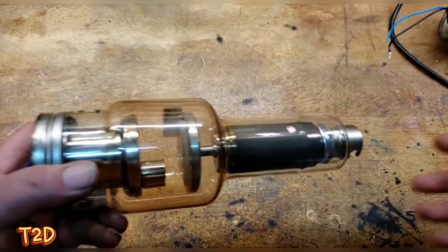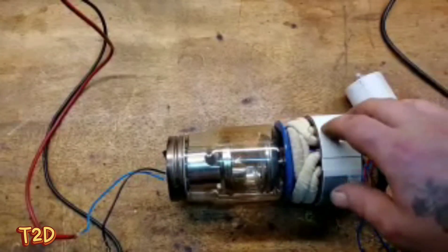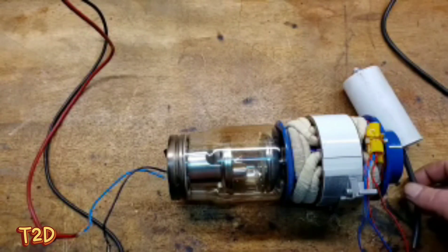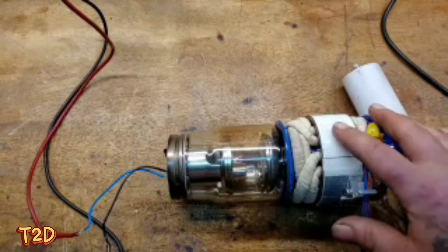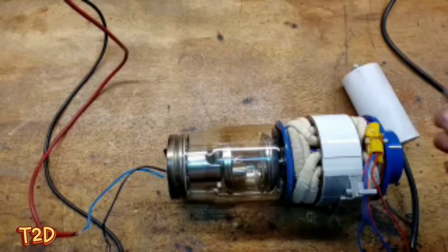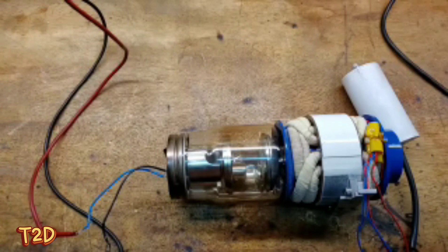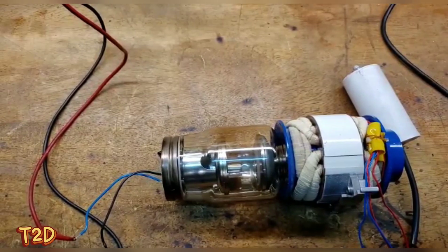Now we'll put on the stator and run this up so you can see it rotating. We've added a capacitor to create the phase shift needed for the induction motor to spin. We've got the stator wired up to a variac and the heater wired up to a power supply. We're not going to apply any high voltage - we don't want to generate x-rays, that's not safe and is probably illegal. We'll just demonstrate the rotation and heater operation.